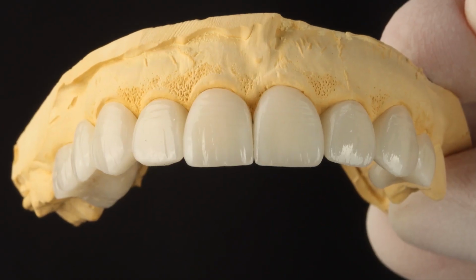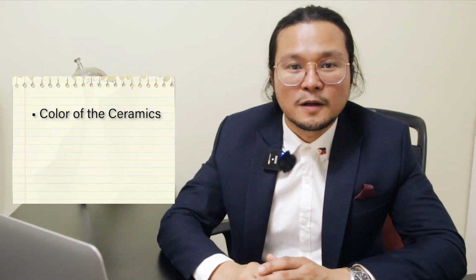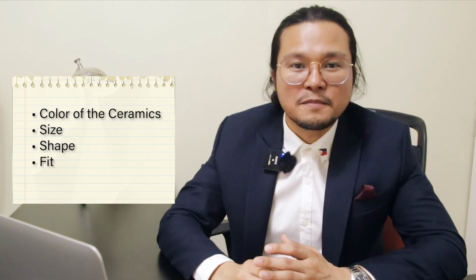After 10 days, that's the time na nag-try-in na kami. So during try-in, syempre doon makikita natin if okay na, like color of the ceramic used, and also the size, the shape, and the fit. That's the most important, because if not properly parang swak doon sa mga margins, then it could pose a problem in the future, and we don't want that.